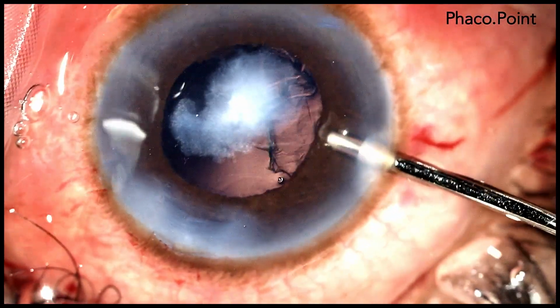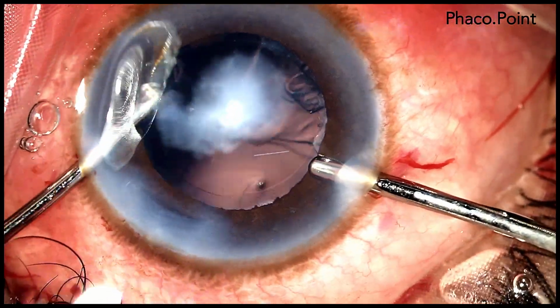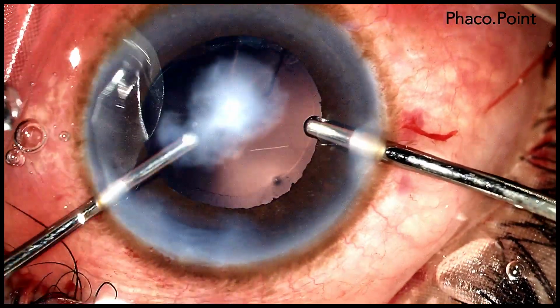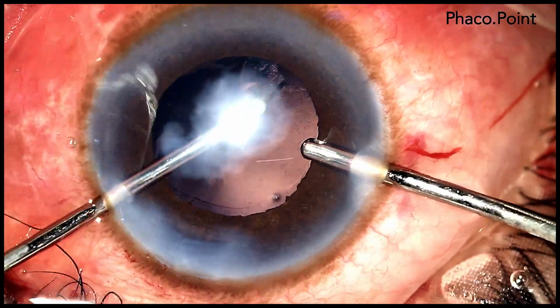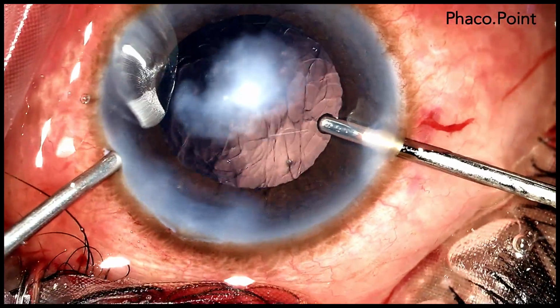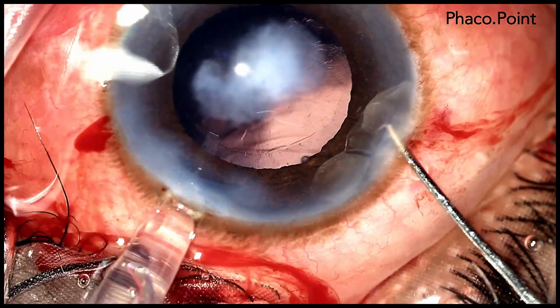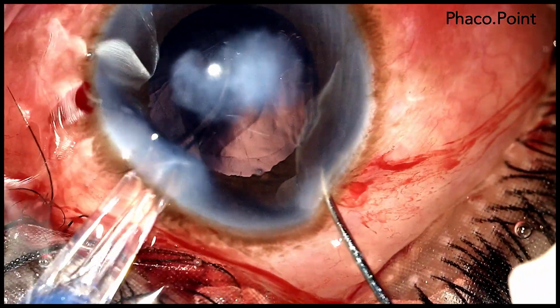In such patients with the corneal opacity, sometimes I find with the irrigation and aspiration cannula in the eye, using the irrigation cannula to roll the eye either to the left, right, superiorly or inferiorly adds to the ease of removing the cortex by enhancing visibility depending on where the corneal opacity actually lies.